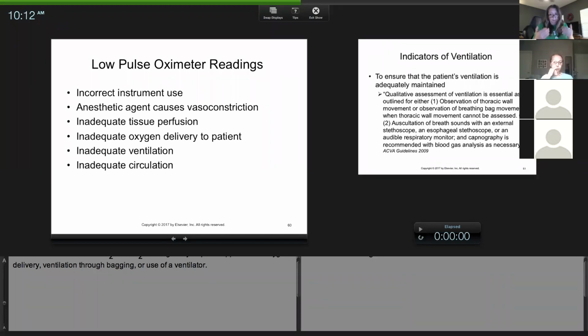When I have a problem with a patient, this is important to understand. When I have a problem with oxygenation or breathing, there are 2 sides to the equation. Is the oxygen getting to the patient? And then, is the patient using the oxygen I'm providing? Right about the point of the endotracheal tube, if everything is fine with my machine, my oxygen, my probe, my endotracheal tube, then the oxygen's going inside the patient. Now, what is happening inside the patient? If you see where I'm getting at, I can check everything on this end. So I check my oxygen source, and check your endotracheal tube.